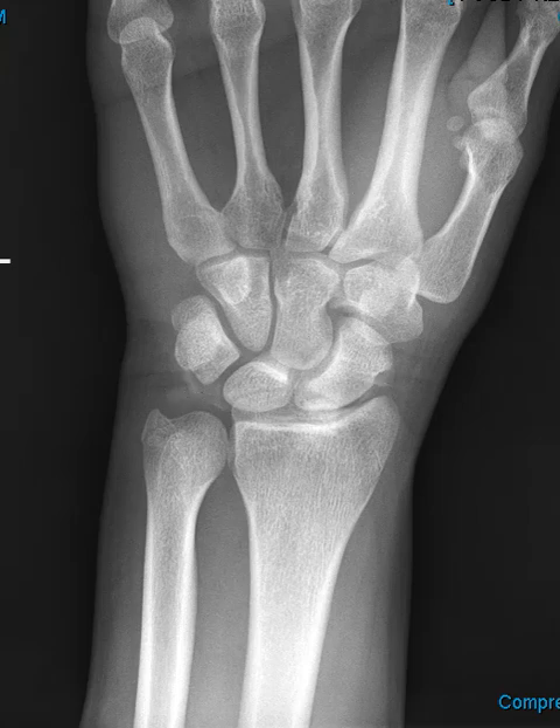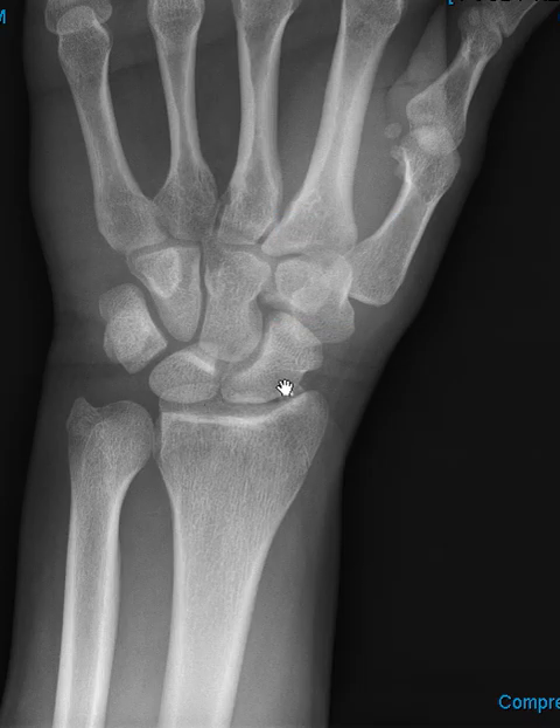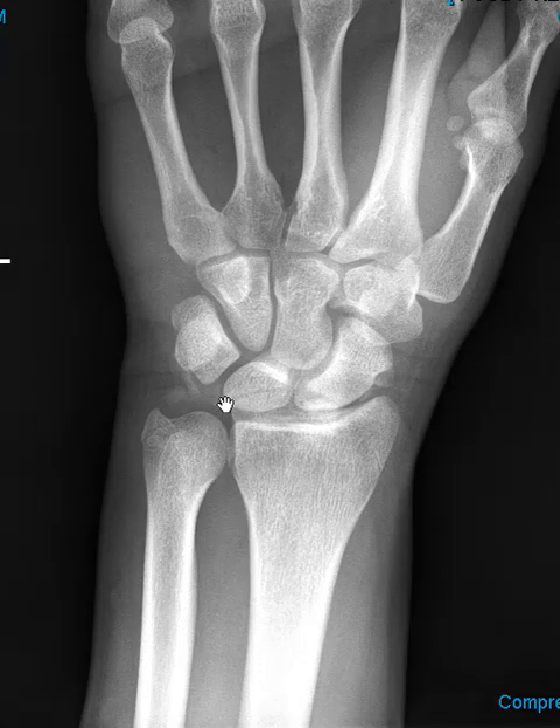Going back to this view, you can see there's no contrast in the joint, and now contrast has been injected. I've removed the needle, but you can see the contrast in the joint — it goes all the way across. We only give about one or two cc's, a very small amount, because the joint is small. The TFCC is right here — that little dark area with no contrast. The TFCC is intact. If it were torn, we might see contrast go down through the tear. There's no contrast in the mid-carpal compartment; it's all contained in this joint.